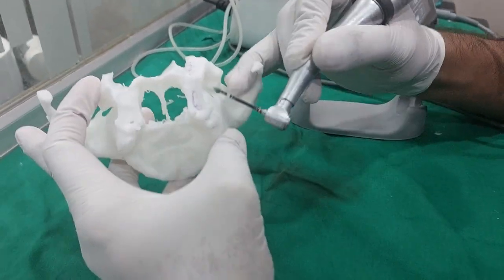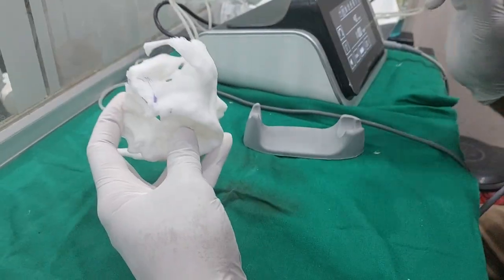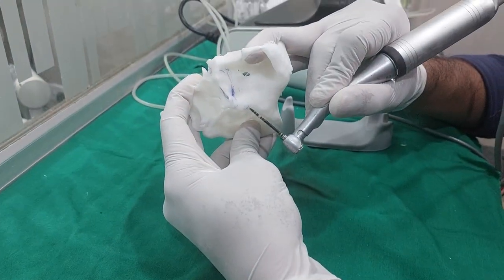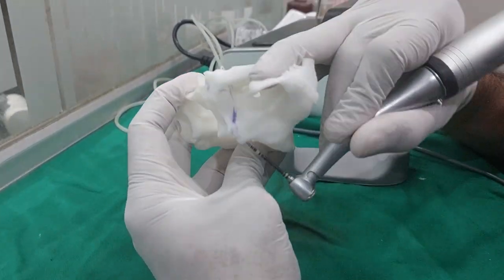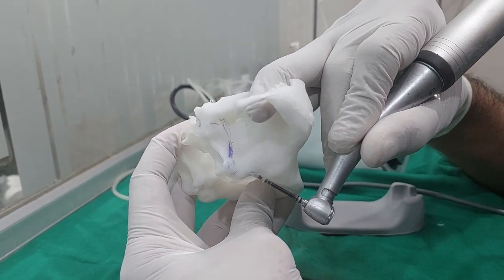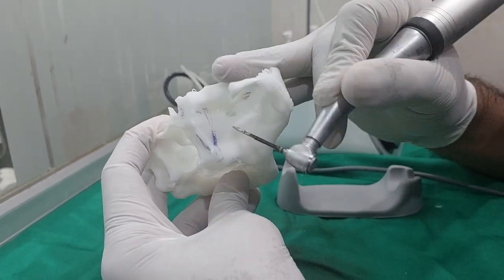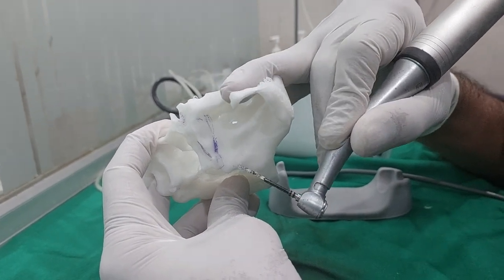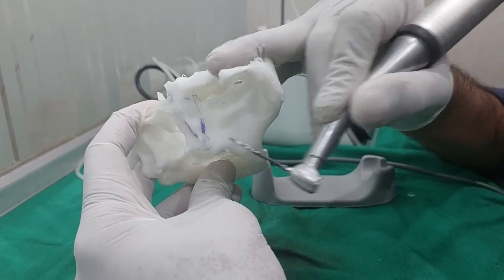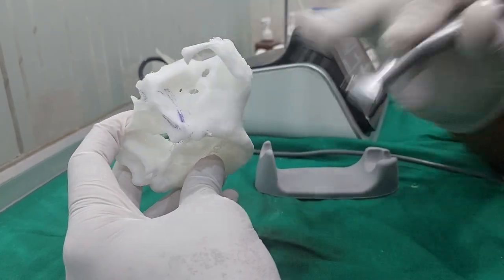I will not target that area - I will target the fusion zone. My point of entry will be like this. I will pierce at an angle. See the angle. Then after this, I will take an x-ray. I will assess the posterior wall of the sinus and the distance from the sinus. Even if the implant path is through the sinus, no problem - your implant crest and implant apex should be in the cortical bone. If the middle part is within the sinus, there is no harm.